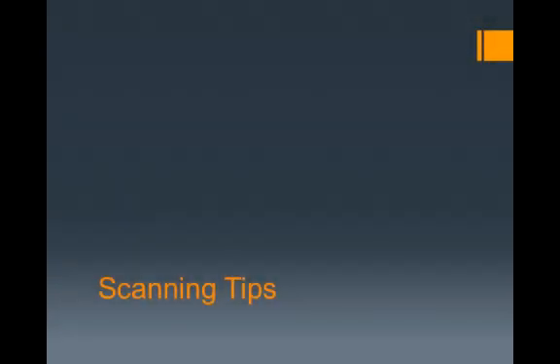Having covered some of the abnormal findings that you might encounter with patients experiencing right upper quadrant abdominal pain, we now provide some scanning tips. If visualization of the gallbladder is proving difficult, 2 guidelines will generally prove helpful. 1, have the patient take and hold a deep breath. This may bring the gallbladder below the level of the costal margin, aiding in visualization. 2, change the position of the patient. Keep these tips in mind as we survey the common challenges encountered in the gallbladder exam.